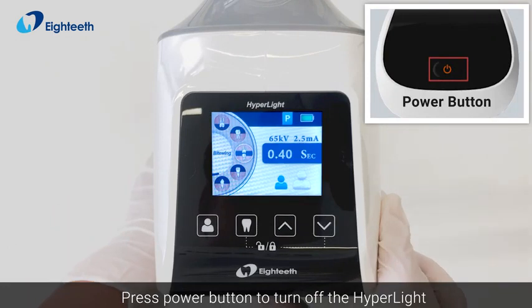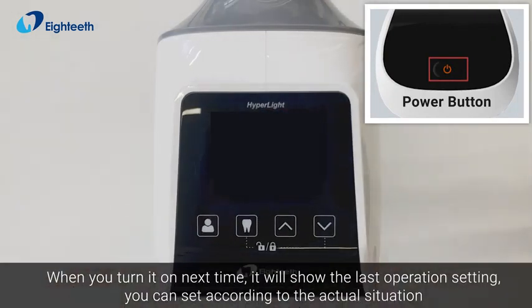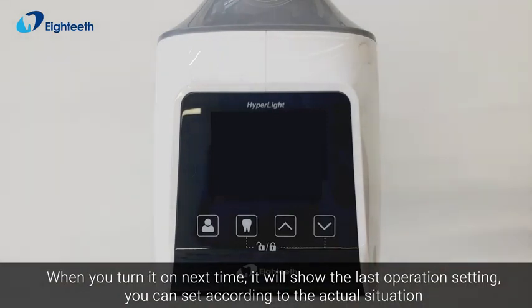Press the power button to turn off the Hyperlite. When you turn it on next time, it will show the last operation settings, which you can adjust according to the actual situation.